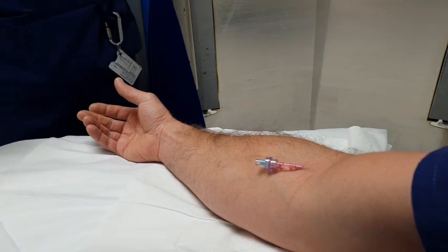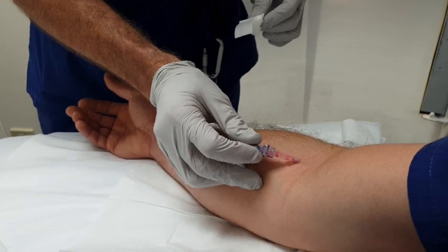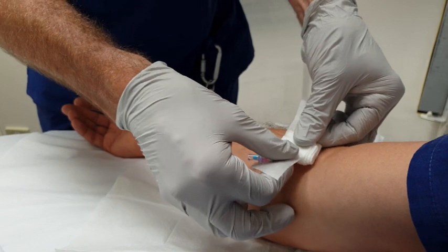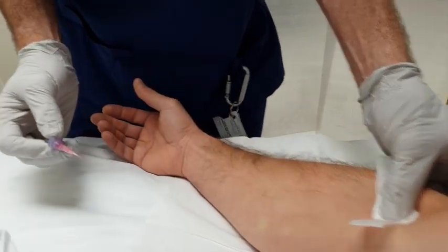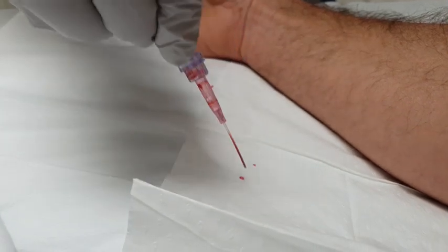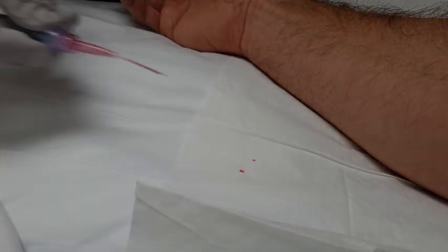You can see the dressing's off now — it moves around freely, it's just a bit of plastic in there. We do have little IV dots but for the purpose of this I'll put a wad of gauze over there and you can watch it slide out from the vessel. And that's what it looks like — that's the bit of plastic, with a bit of Pat's blood in there. That's why it moves around so freely inside. And that's it. So that's the process of intravenous cannulation — pretty simple as you can see, and I don't think you're going to have any problems with it.